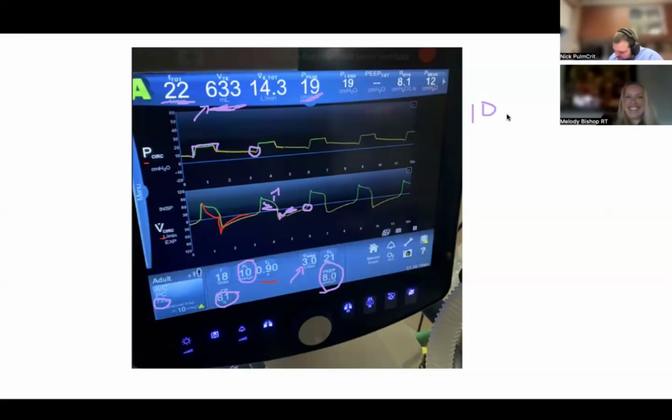Yeah, no, but for this guy, eight mLs would be, so 70 times eight would be like 500. Yeah. So if this was emphysema or COPD, my approach is based on this number, which is the minute ventilation, because they probably need a 14 liter minute ventilation to account for their dead space fraction. How am I getting that?